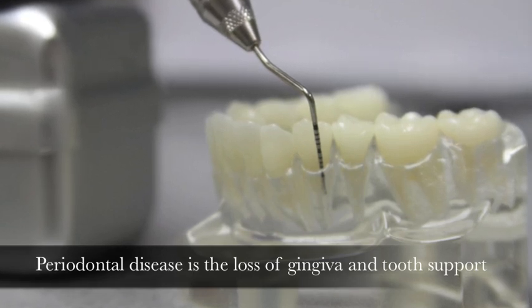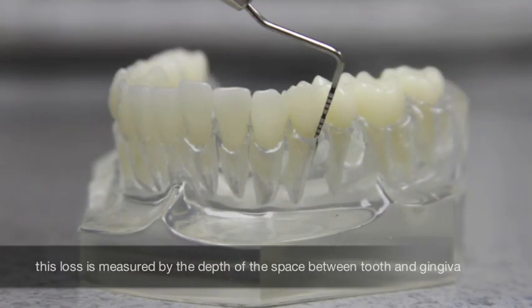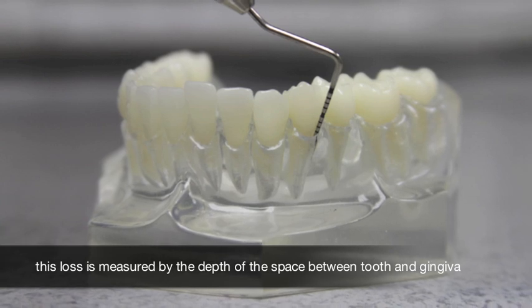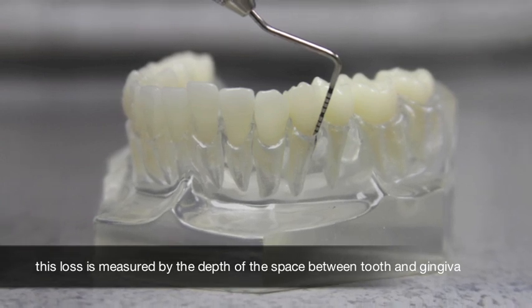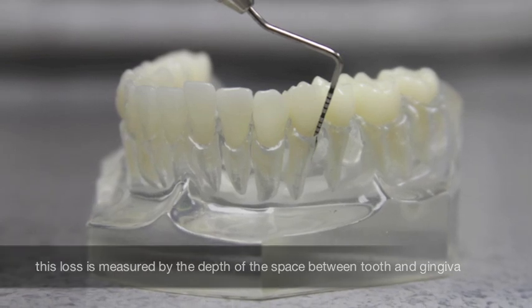A number between one and three millimeters indicates healthy tissues, but when the numbers increase, particularly greater than five millimeters, this often indicates a loss of tooth-to-gingiva attachment. This is called periodontitis and is evidence of periodontal disease.